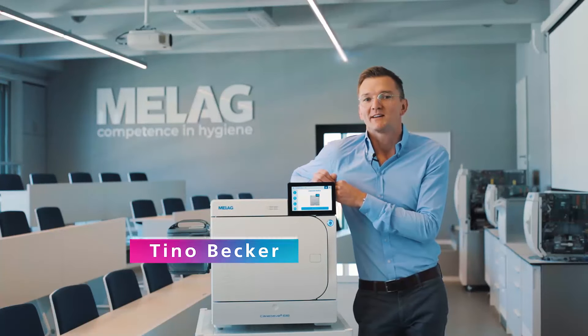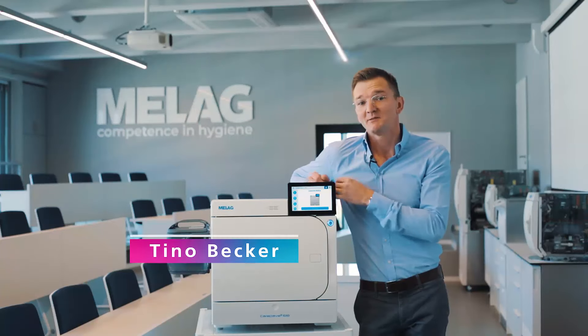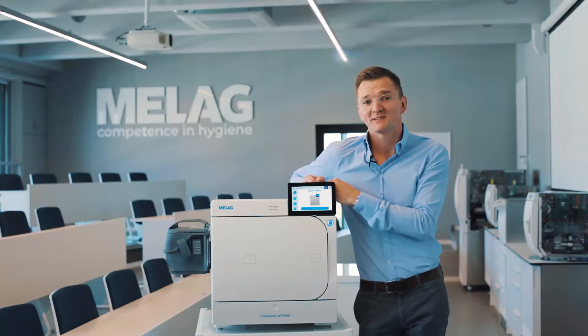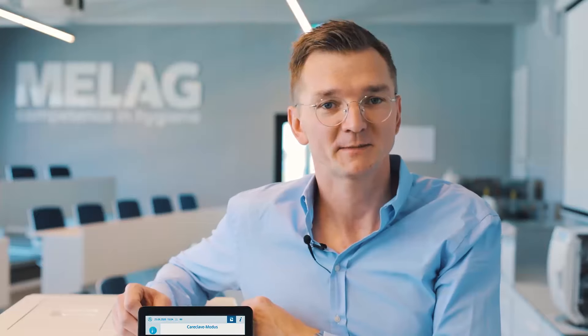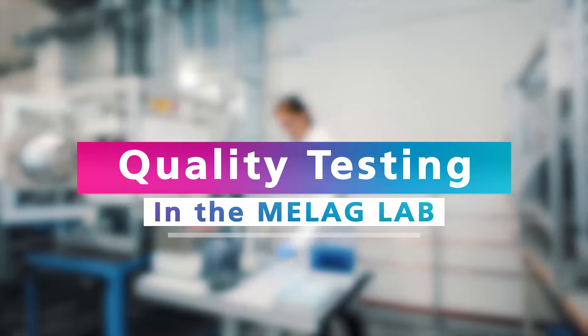With the CareClave, we completely redefine the reprocessing and lubrication of your instruments. To be entirely confident in our innovation, we have subjected the CareClave to extensive quality testing procedures.